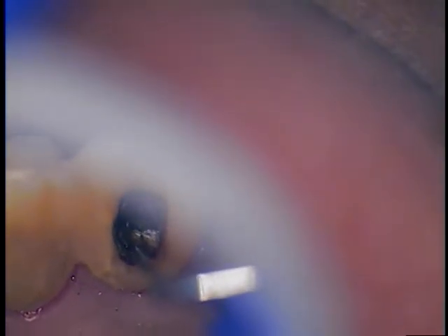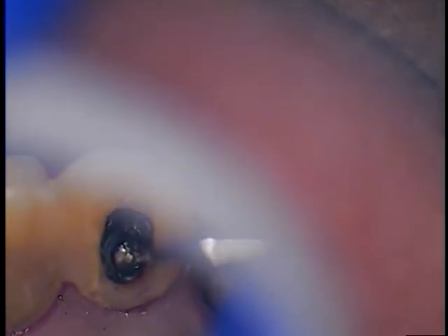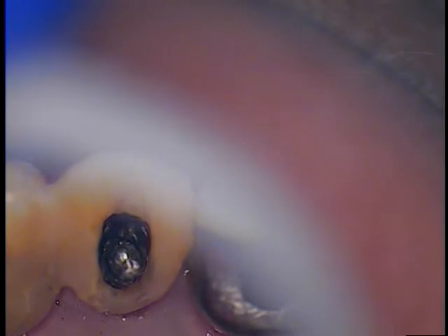How delicate it is, isn't it? Just spinning around. Maybe these screws are made to stay within the abutment. I didn't think of that. I checked the last abutment I used, but this is a titanium. I'm just wondering if it's made to stay in there. And if that's the case, the next step is to get the whole abutment out, which we're going to try to do another day.